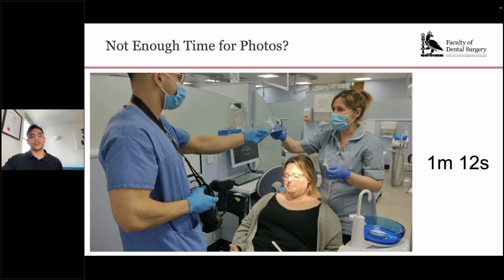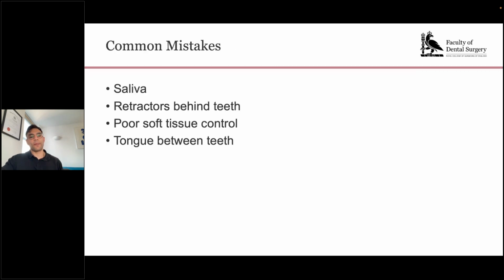And that whole process took 1 minute and 12 seconds. So if everyone's well versed and if it's a slick and consistently performed routine, it can be done really quickly.